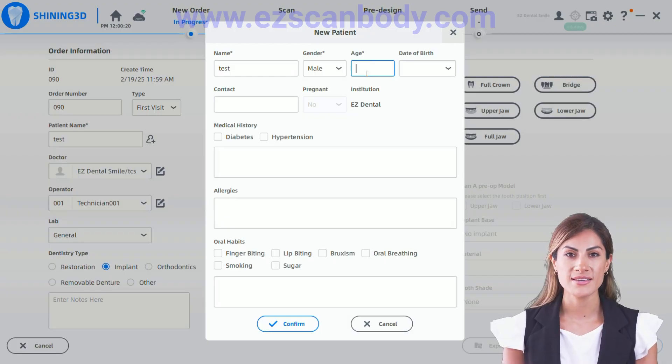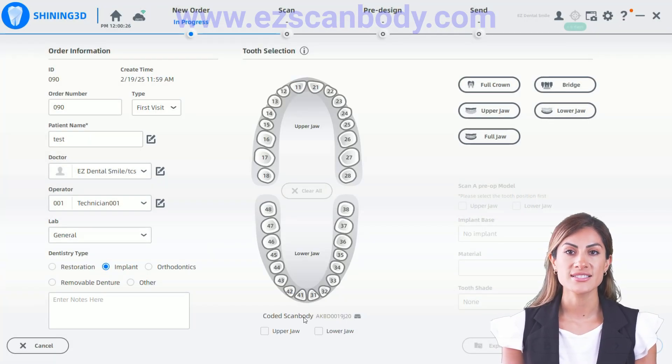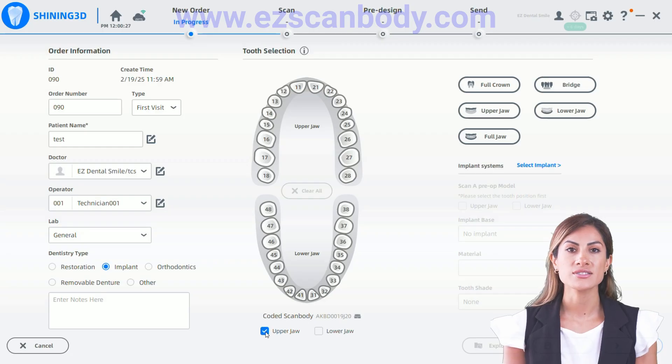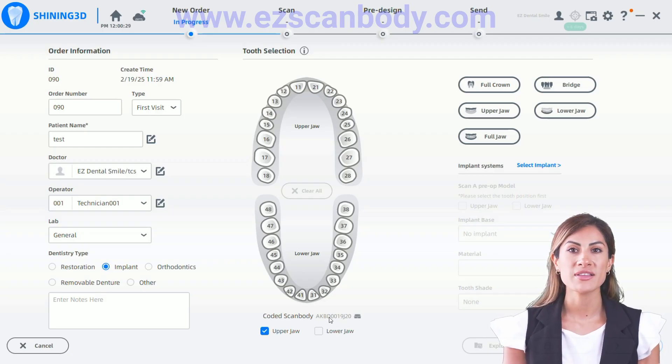In the Dentistry Type section, select Implant and click on the tooth number where the implant is placed.